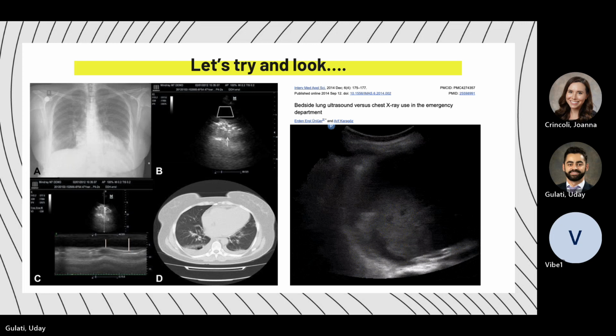Is it a CHF exacerbation? Is it pneumonia? There's this little hazy infiltrate right here. And so in this rapid response, I don't think anyone here confidently has a clear diagnosis, and I think they're going to be giving antibiotics and diuresing, in my opinion, unless you guys feel strongly otherwise.